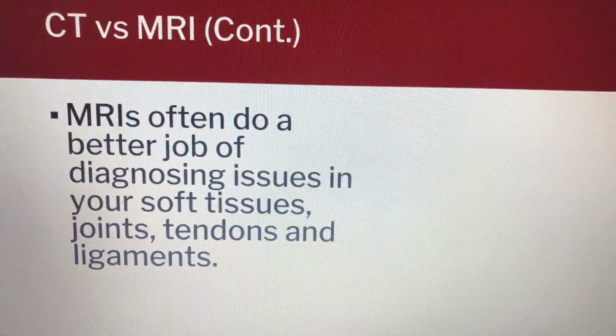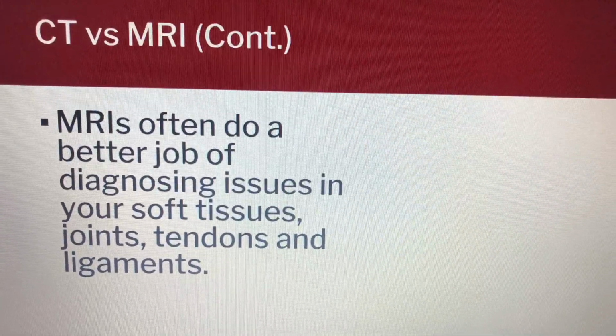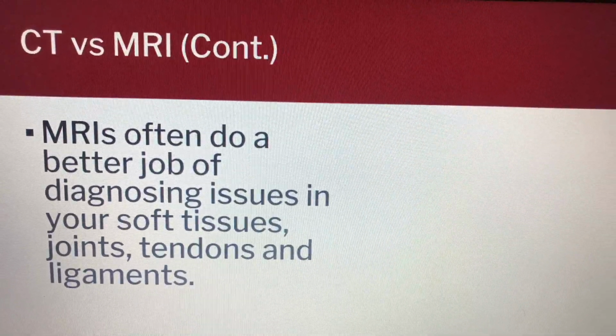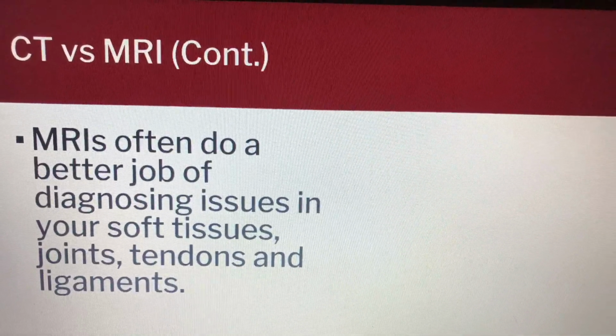CT versus MRI, continued. As said before in the other slide, with the comparison of the pictures, an MRI is better used for diagnosing issues in your soft tissue, joints, tendons, and ligaments.